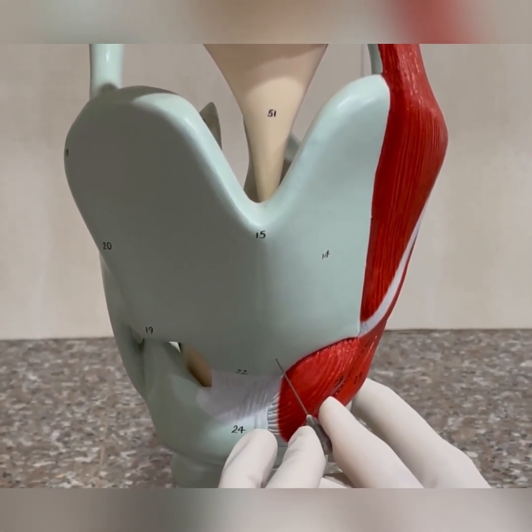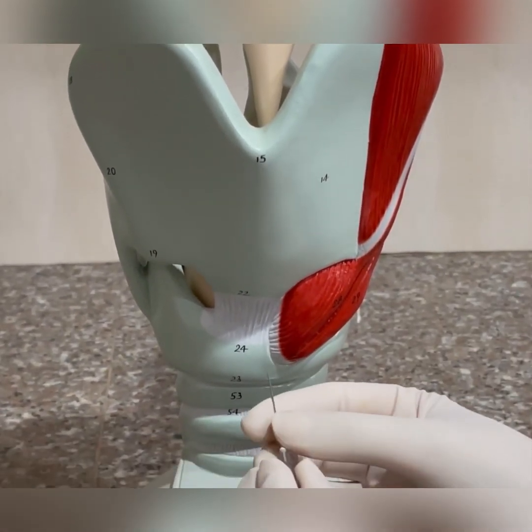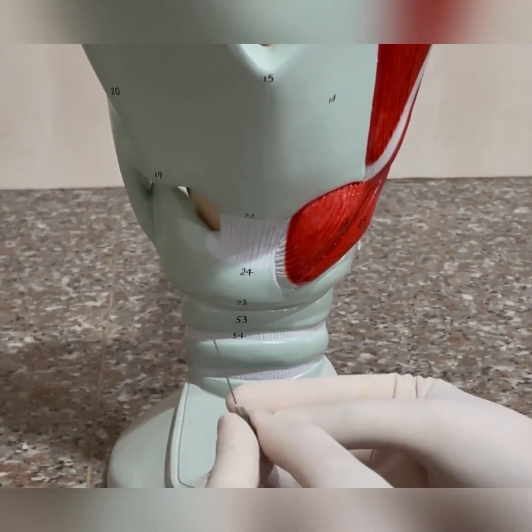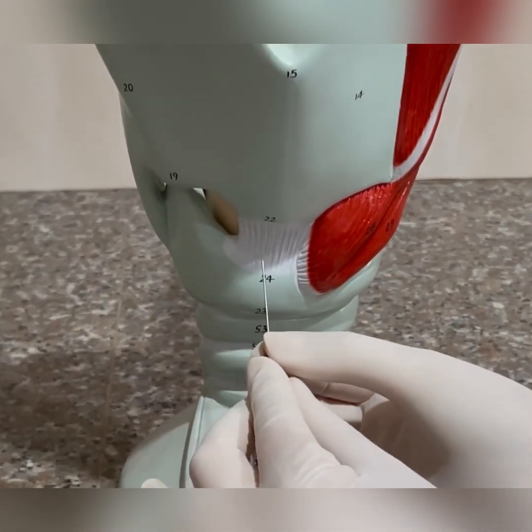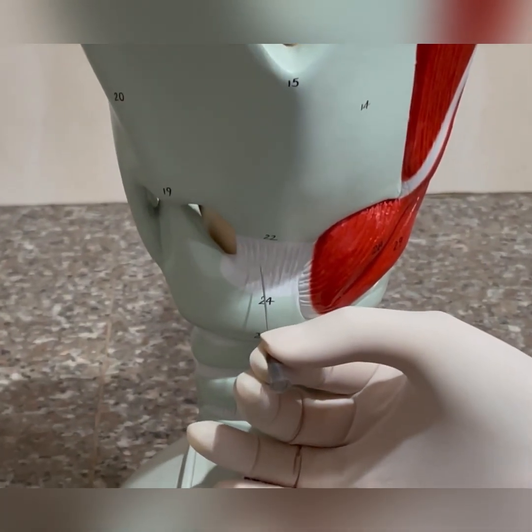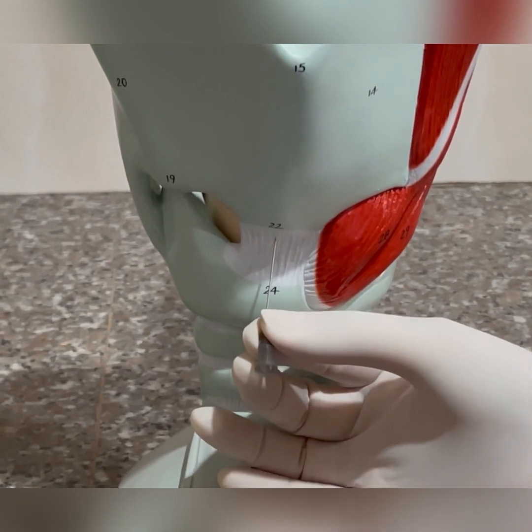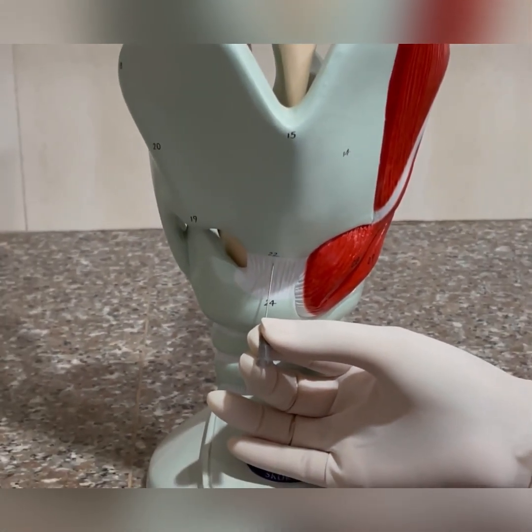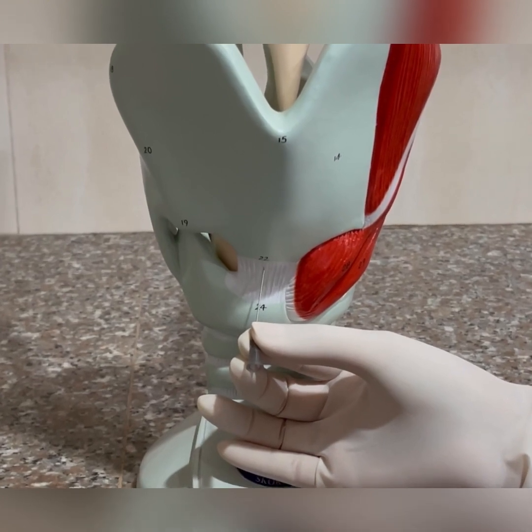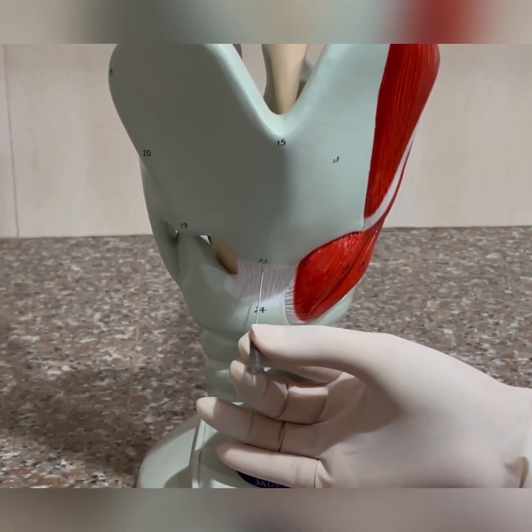The other method is the cricothyroid approach, where you bend the needle by 15 to 30 degrees and go in at the midline in the cricothyroid space, hugging the lower border of the thyroid cartilage, angled 30 degrees upward and laterally toward the side you want to inject. With this route, you would be injecting the infraglottic side of the vocal fold.